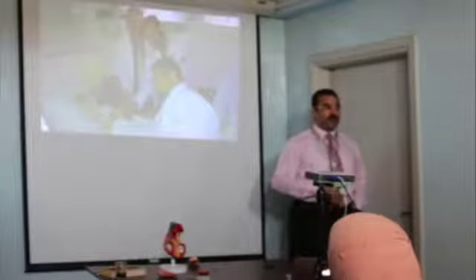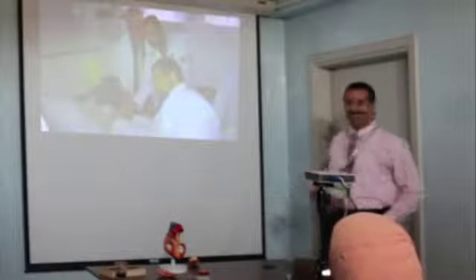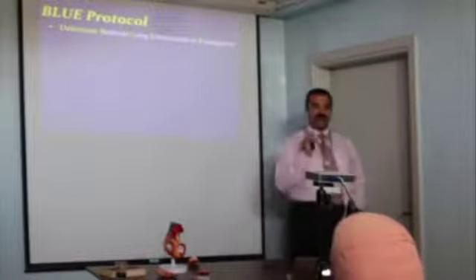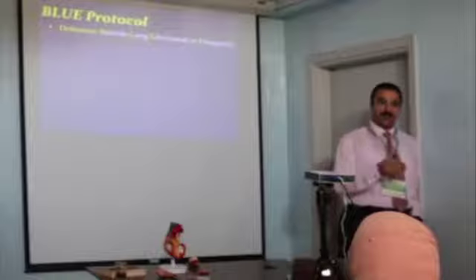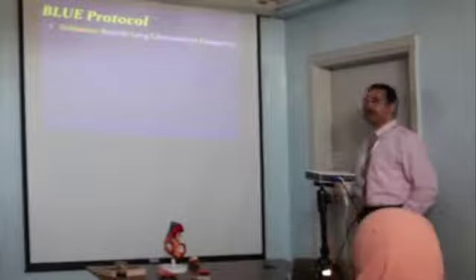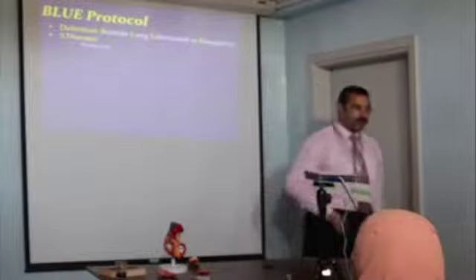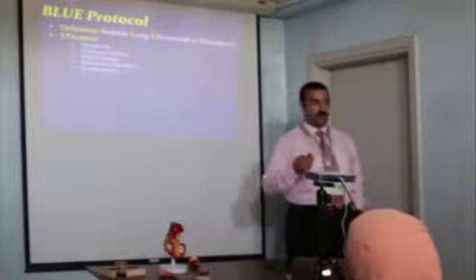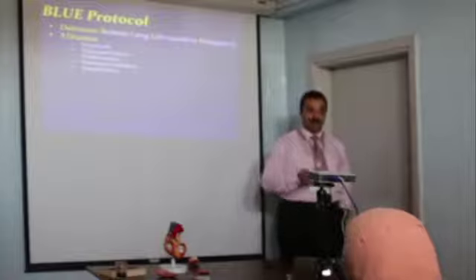Are you ready to rock? Are you ready to start the BLUE protocol? Who knows this man? The BLUE protocol, what's the meaning of blue? Any cyanotic or hypoxic patient will get the BLUE protocol, so it is bedside lung ultrasonography in an emergency patient, provided they are hypoxic. Okay? Five diseases I can diagnose with the BLUE protocol: pneumonia, pneumothorax, pulmonary edema, COPD and asthma, and pulmonary embolism. You can go through all these diseases and diagnose them. As I said, Daniel Lichtenstein diagnosed with 90% accuracy.